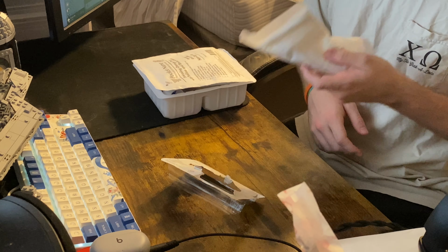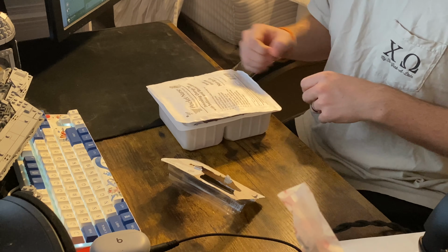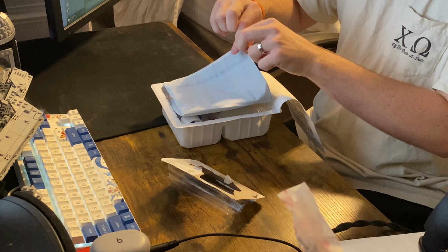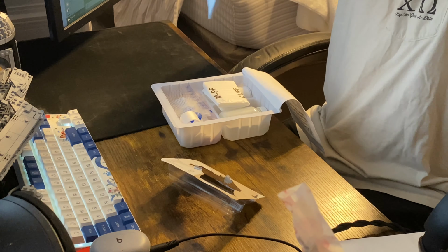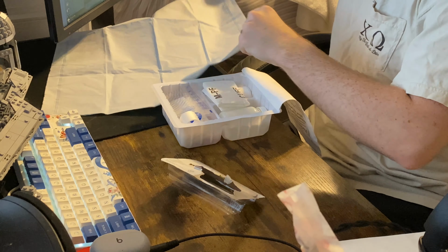We'll dispose of the old bandage properly, and then we will get our own kit and begin preparing to change out the dressing. The first thing to do is going to be setting our sterile field using that inch border we have, and I will lay that over here.